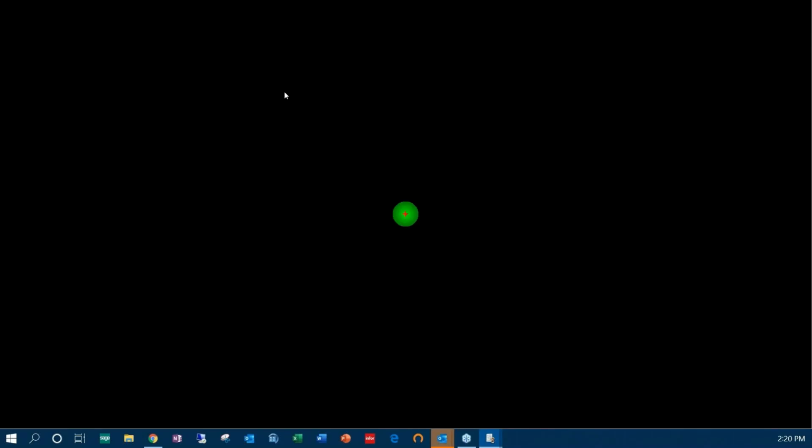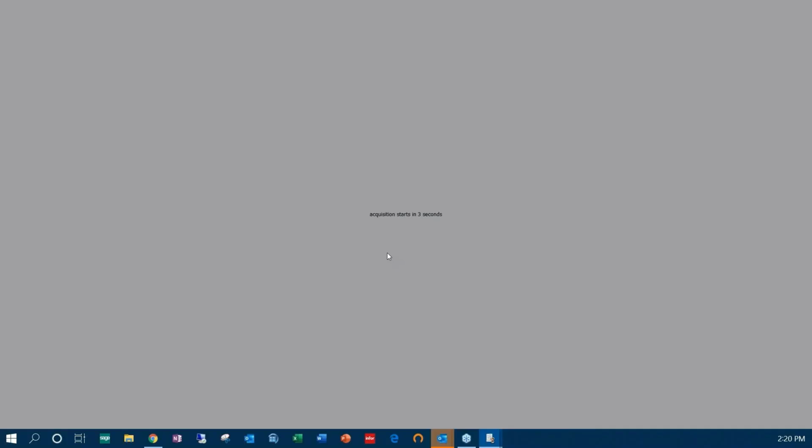And now we're at the point where we're going to do our 5-point calibration. So I'm just looking at the green dots on the screen. And once we've completed that, we get the markers to show that I was hitting the target. A little bit off here, but I'm going to hit accept. I could redo that. I'm going to hit accept.